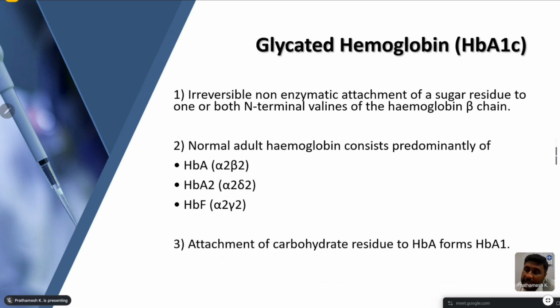Coming to the topic, that is the use of HPLC in HbA1c. Okay, so the institute which is using a Variant 2 Turbo for hemoglobinopathy, what are you doing for A1C?